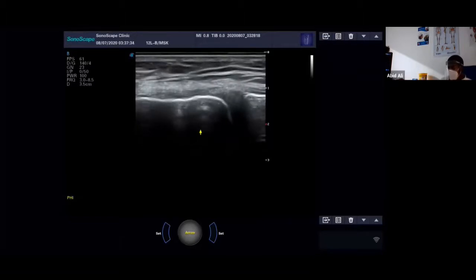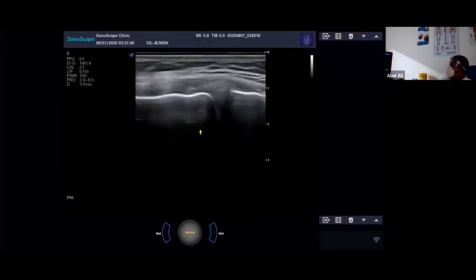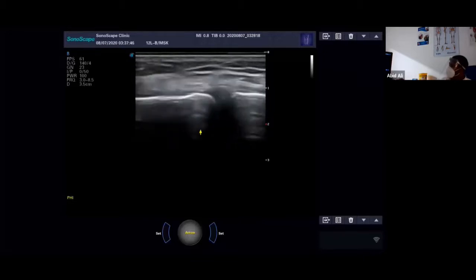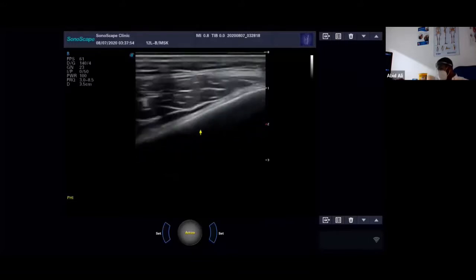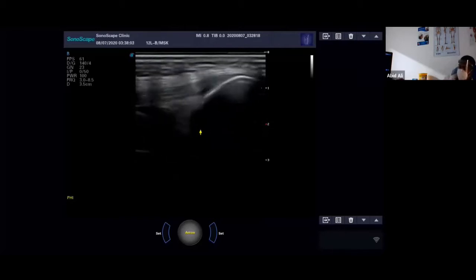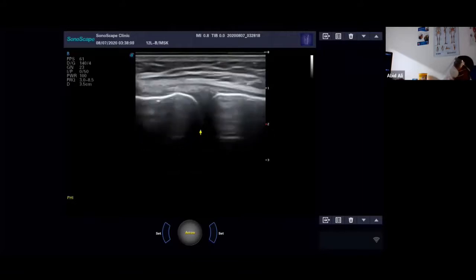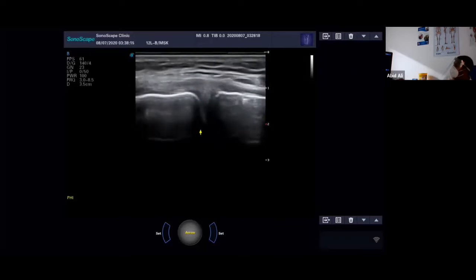Yeah. So first of all, look at the joint line. Assess that. Meniscus, things around the joints. Effusions. Do you tend to see effusion in the medial or lateral joint margins? You can do. Usually, if you look at the anterior knee, you'll get an effusion. Sure, suprapatellar pouch. Yeah, which will extend medially and laterally. So you'll see effusion over on the medial side and also on the lateral side. You won't see any in the actual joint margin itself. Well, you could do. You could see effusion pop out here. Yeah. You could see a cyst. Hematoma. Hematoma.